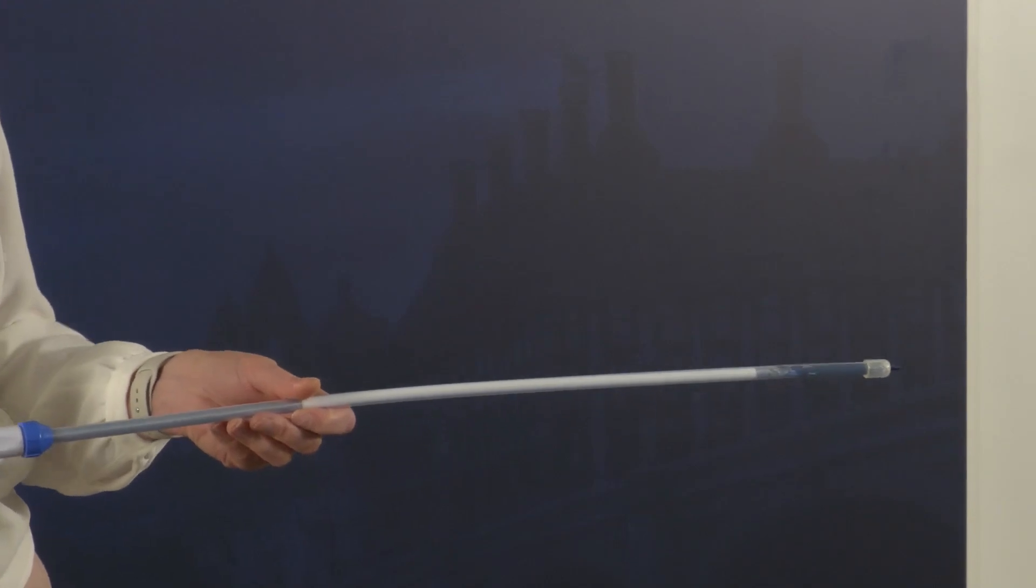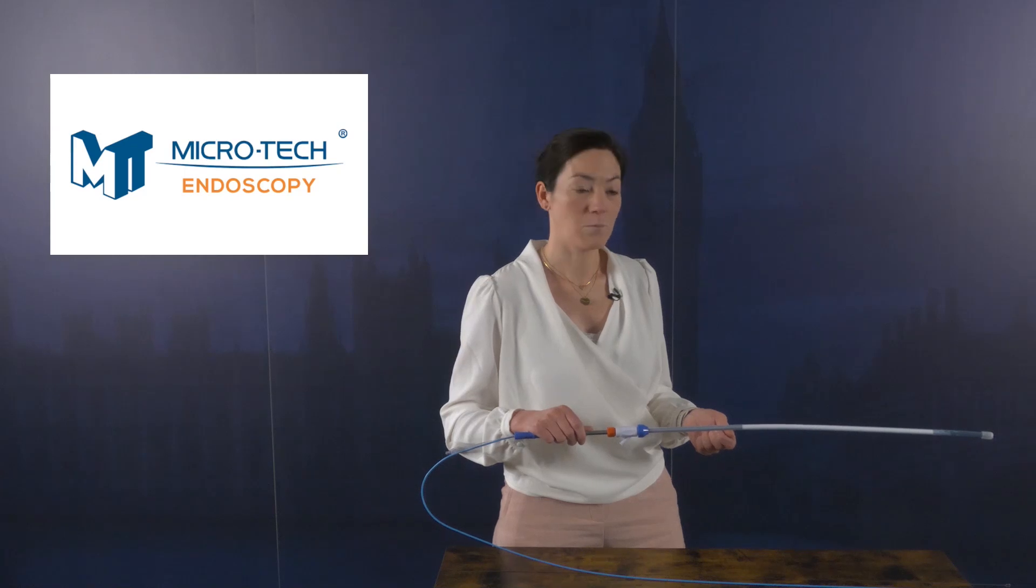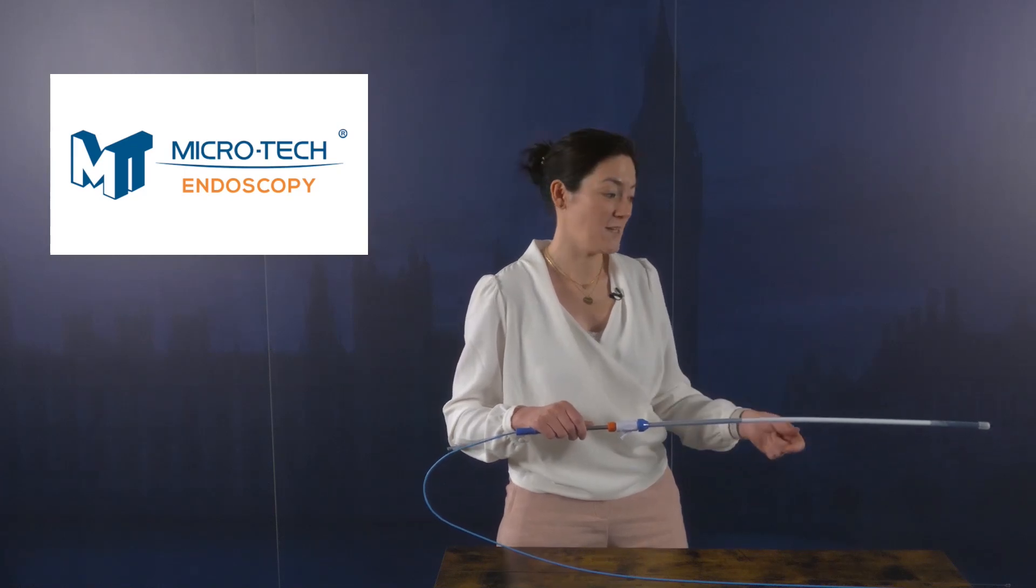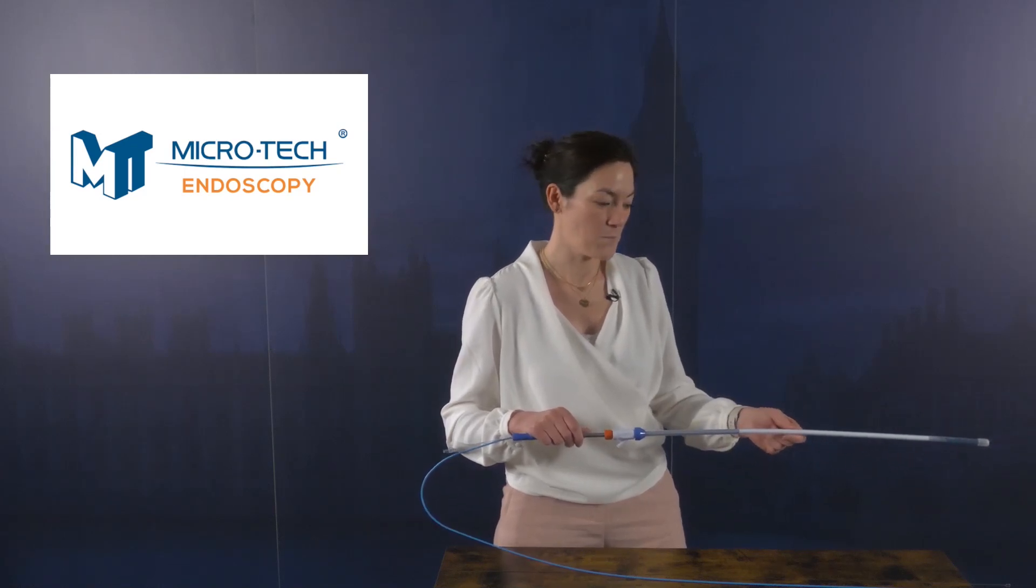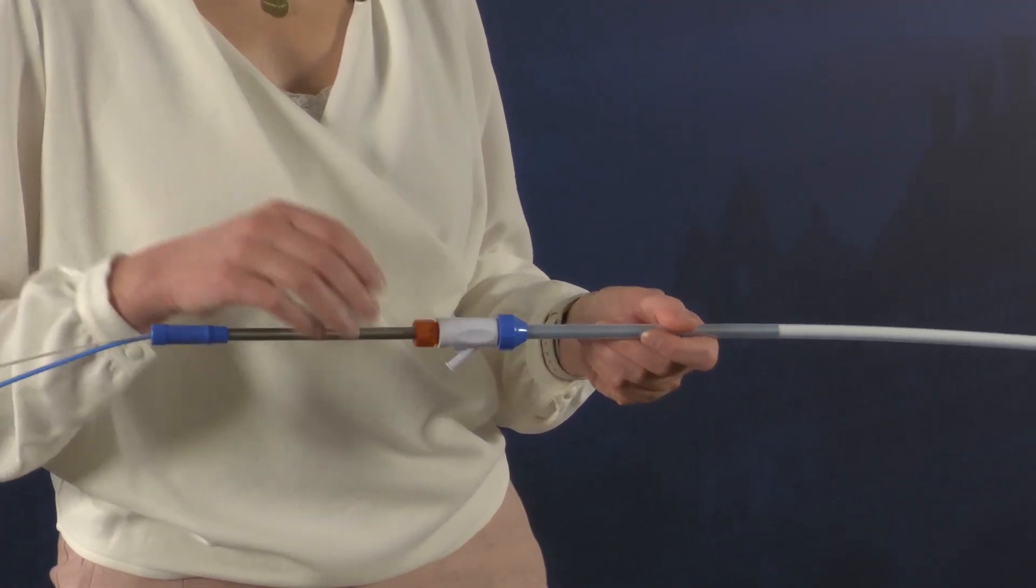If you're then happy with the position, either based on your endoscopic view or on your screening view, as was nicely demonstrated in Vinnie's video, you can ask the nurse to deploy the stent.